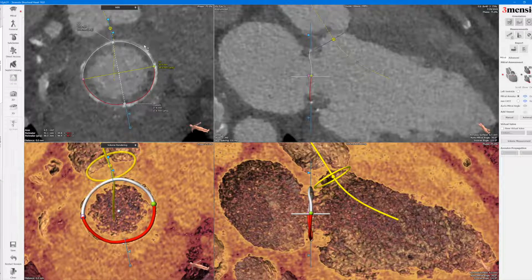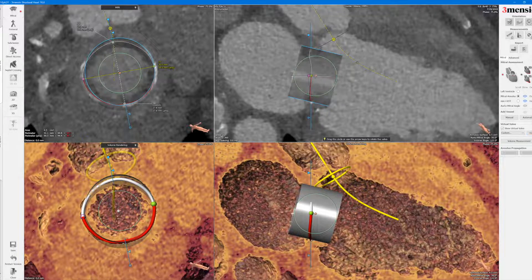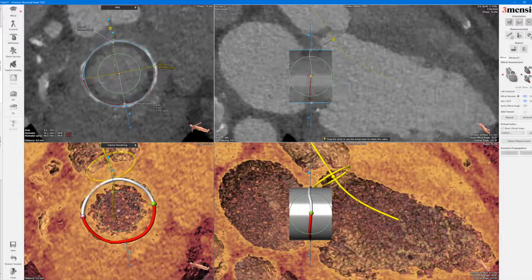Even with a 31mm surgical valve, you will have an internal diameter between 28 to around 30mm, so your valve will be a 29mm balloon-expandable valve. Once you have that, you go to show virtual valve and click edit to make sure it's set to 29. Your frame height for a 29mm balloon-expandable valve is around 22mm. Then you right-click the pink dot and say snap to valve — when you do snap to valve, it centers it.